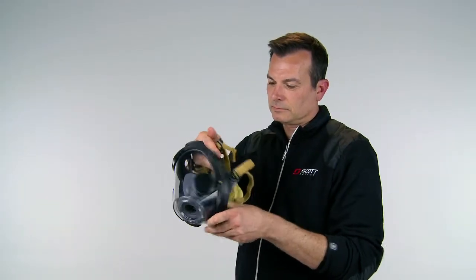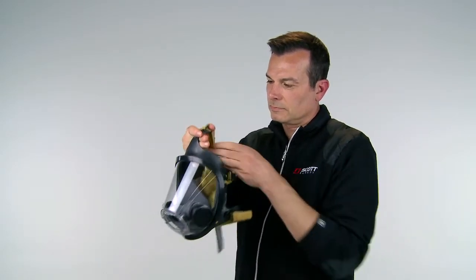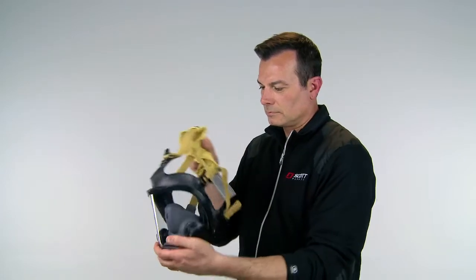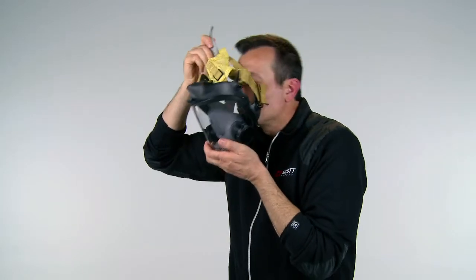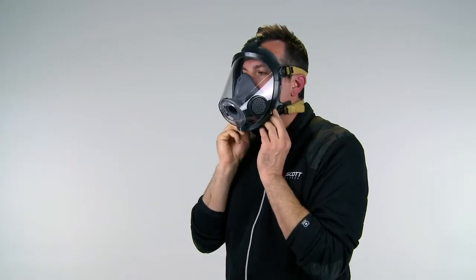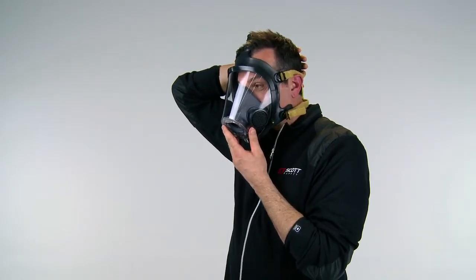Adjust the head straps to their full outward position. Hold the facepiece in one hand and hold the head harness by the strap at the base of the headnet. Place the facepiece on the face with the chin properly located in the chin pocket while pulling the head harness over the top of the head. The chin must be properly located in the chin pocket throughout the donning process. Stroke the head harness over the head and ensure that straps are lying smooth and flat against the head and neck with no twists. Verify the head harness is centered and properly located at the back of the head.